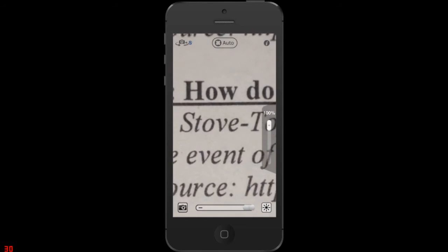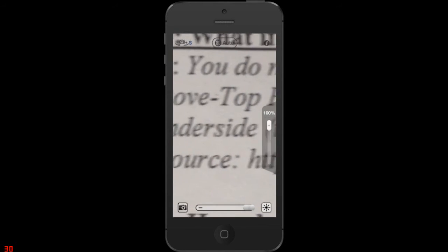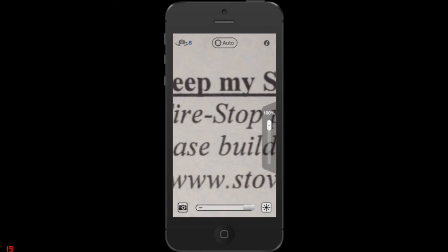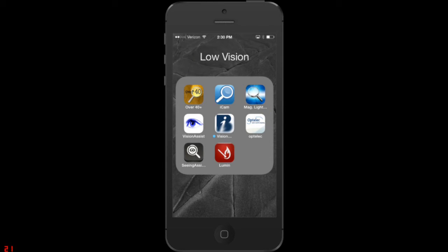So again, you're going to get a lot of the same. Once you see one CCTV, you've kind of seen the majority of them. It really is just a matter of interface, like how the controls are, how big does it get, do they support extra features like freeze modes, color contrasts, that kind of thing. I'm not going to go into a huge amount of detail on all of these, but I just want to show you that these are out there. And they're really cheap.